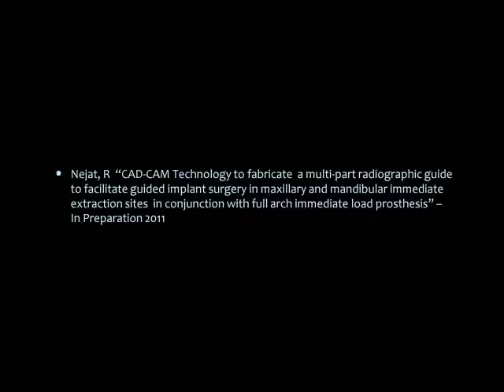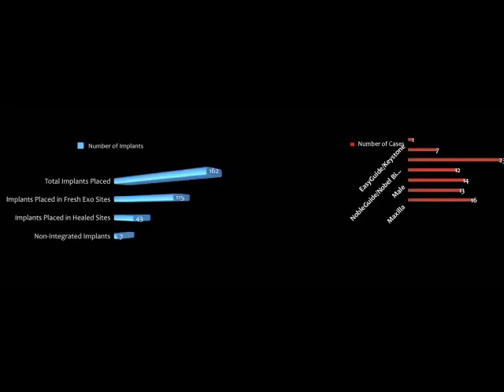So we've compiled our cases over the past 4 years into a publication that we're preparing that utilizes this protocol of guided surgery with a multi-piece radiographic template in conjunction with immediate load with extractions. And what we have is a total of 162 implants placed, and we had about 115 placed into extraction sockets. And we had 43 placed into healed sites with only 7 implants that did not integrate. Our cases were 16 in the maxilla, 13 in the mandible, with almost an even distribution male to female, using different systems out there.